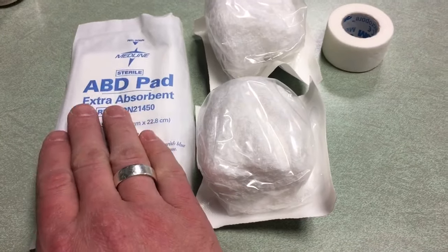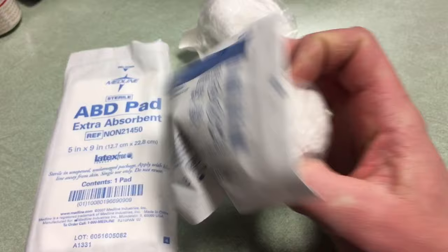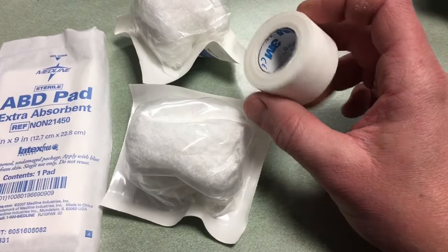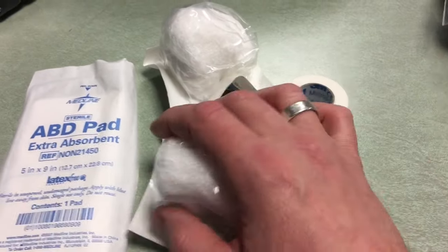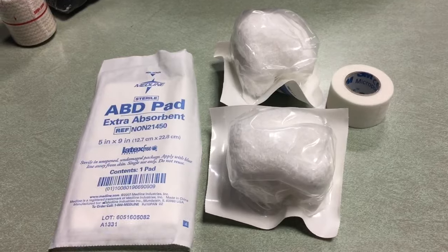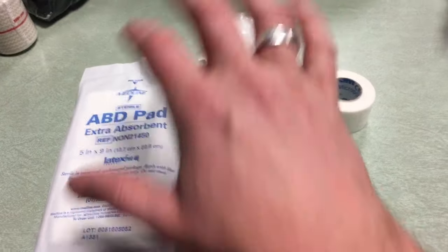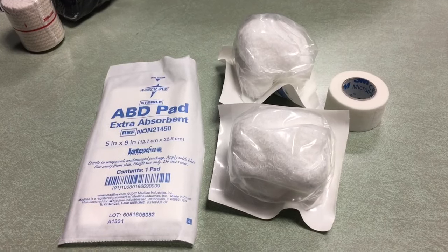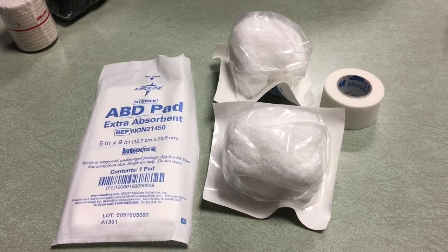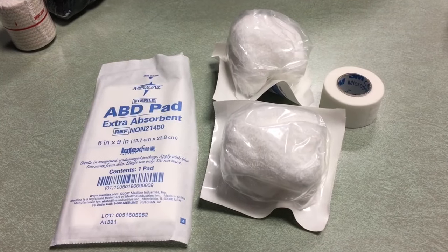First off, we have an AB pad — it says extra absorbent — then two bandage rolls, and some 3M tape. 3M makes my favorite duct tape, so I'm guessing their medical tape is great as well. Obviously this is for a significant situation with a lot of bleeding going on. This is stuff that I'm comfortable using at this point in my life. There will be some items I'll be straight up about and say that's way above my pay grade.